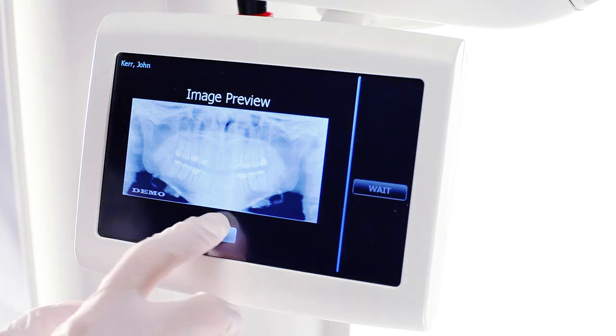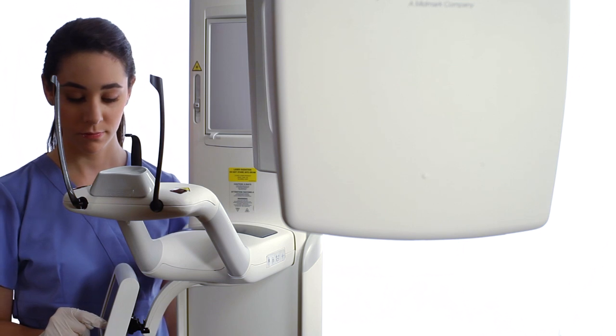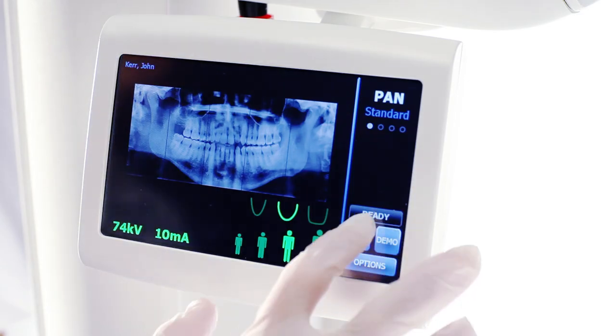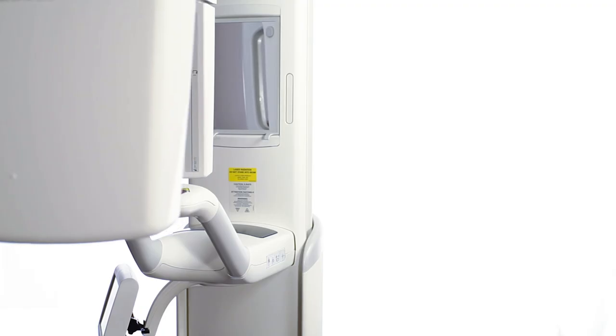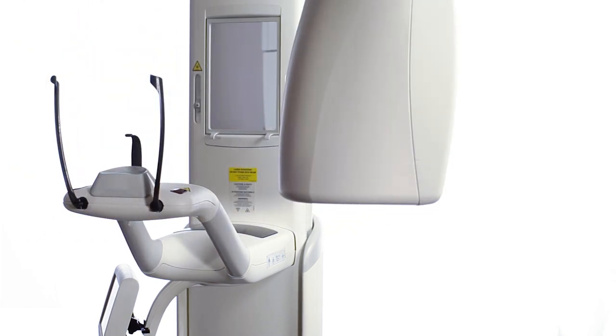Tap OK to accept the image. At the end of an examination, the overhead structure is in the patient exit position. The gray ready indicator verifies this. Press the cycle button on the Vantage Touch once to bring the overhead structure to the patient entry position.